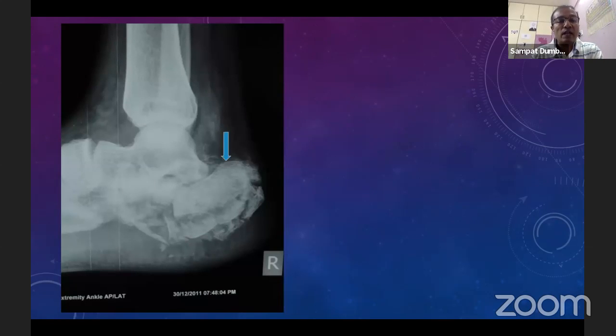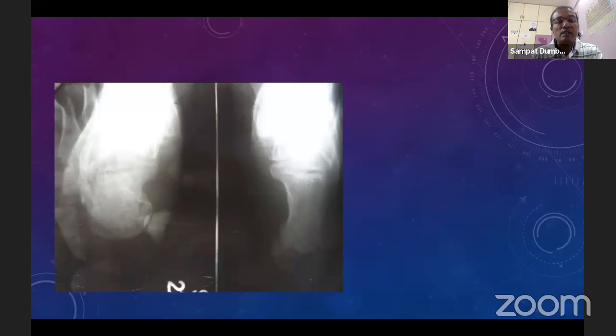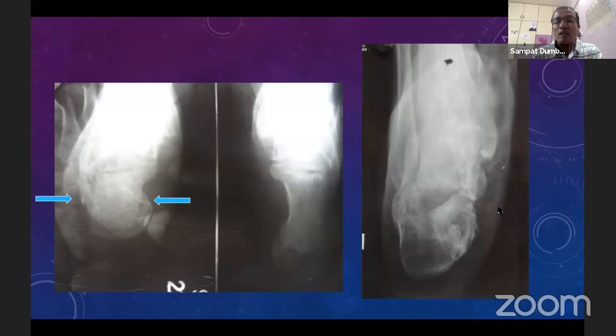Look at the height; we have lost height here. Look at the axial alignment. Here there is a varus alignment, and this varus alignment is absolutely painful. Look at this: again, broadening of the heel compared to the opposite side. This broadening of the heel is also equally painful, and along with the joint alignment, this particular bump exostosis is going to be painful.